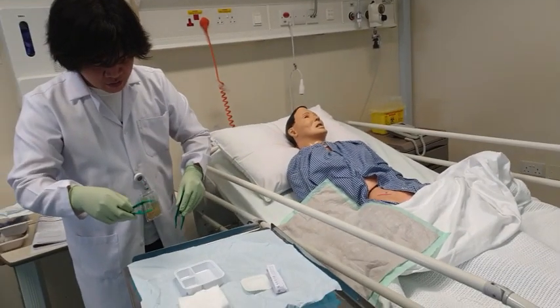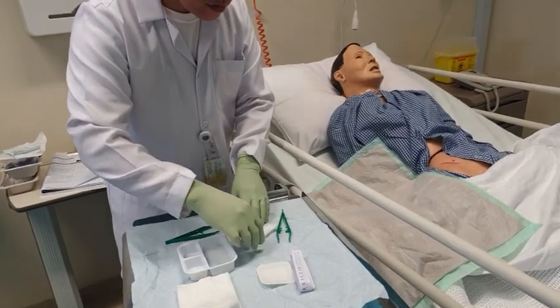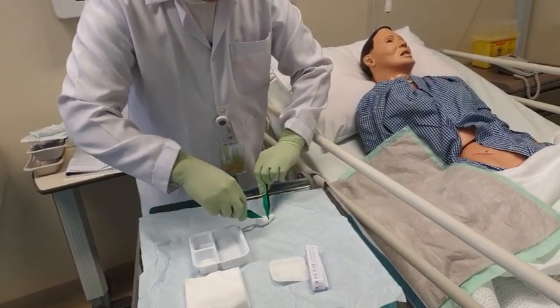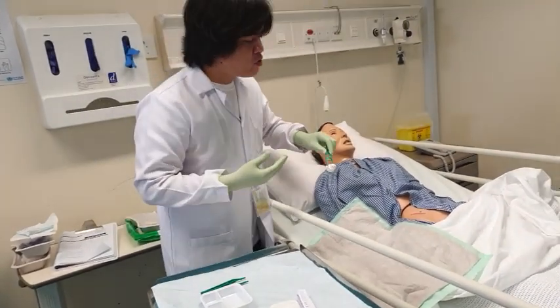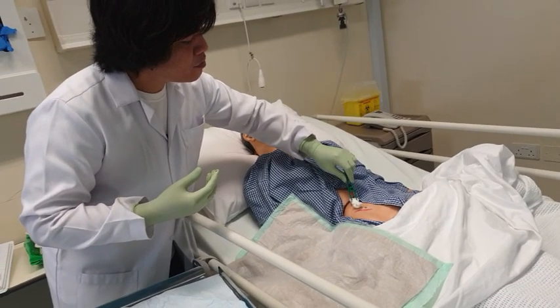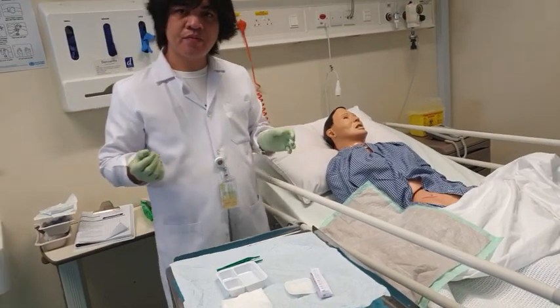Drop this one. Pick another one. Okay? Now I'm going to dry the other side. And now I can drop this one.